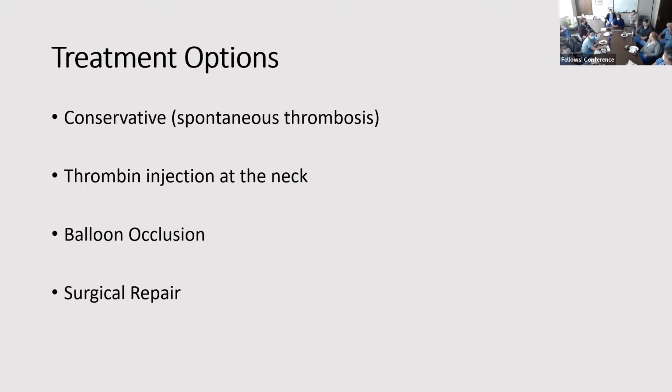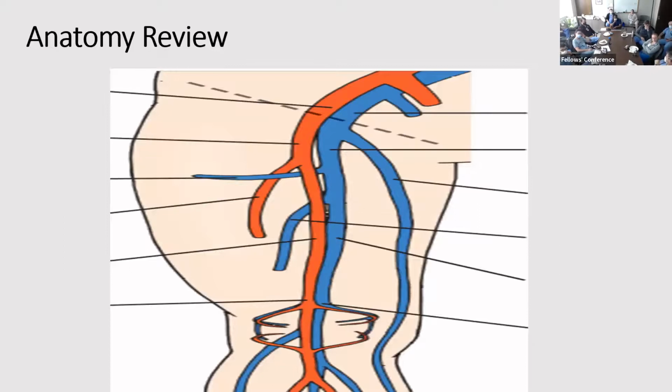except IR and surgery. Where would you, so if the aneurysmal sac is between you and the vessel, you just put pressure on the aneurysmal sac to get there? Yep. That's not going to cause it to rupture? No. It's going to cause the patient a fair amount of pain. You said a lot of pain? Yes, yeah. And that'll be kind of your presenting sign. So the patient will start having significant pain, and then as soon as you touch it, it'll be kind of out of proportion with what someone should have for having a calf. So that should tip you off that they might have one. And that's just because the soft tissues are being dissected in each beat by blood, so it's pretty painful. And the formal workup, is that an ultrasound or a CT? Oh, it's a Doppler. A Doppler ultrasound, yeah.